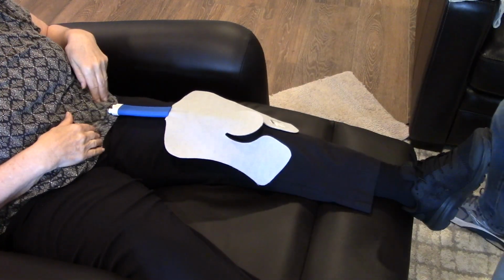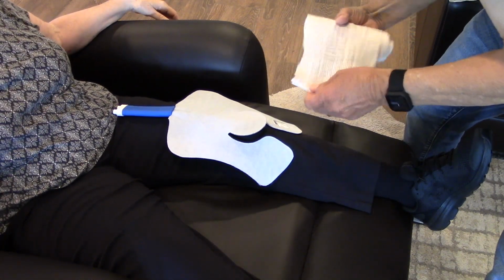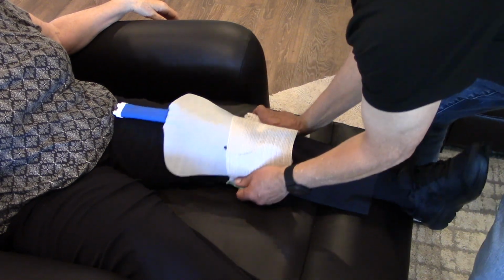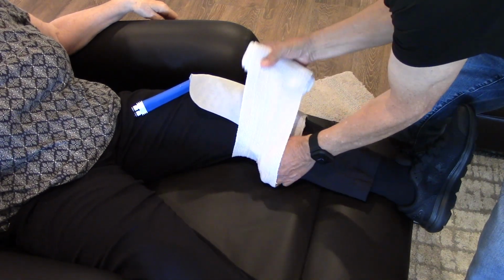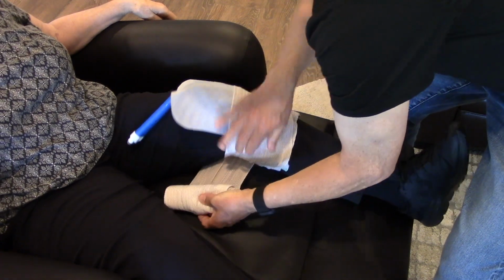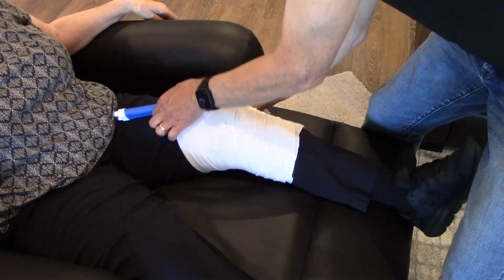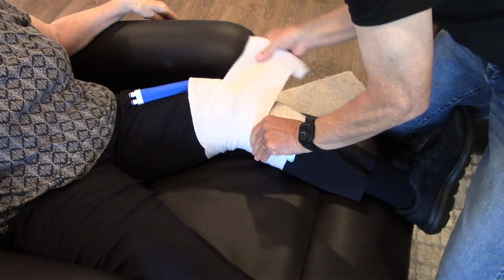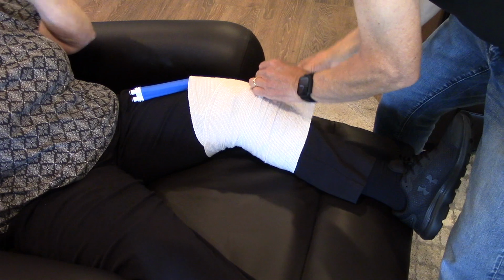And then we use a large ace bandage, and then wrapping it around, I found what works best is we take it and go down like this and come around. Notice how my wife helps me by tipping side to side, and that first one anchors it, and then I kind of did a figure 8 through the joint because she was getting some pain under there. And when we come up here, again, it's a lot of help if there's that rocking in between. And then we're coming around here and kind of finishing it off.